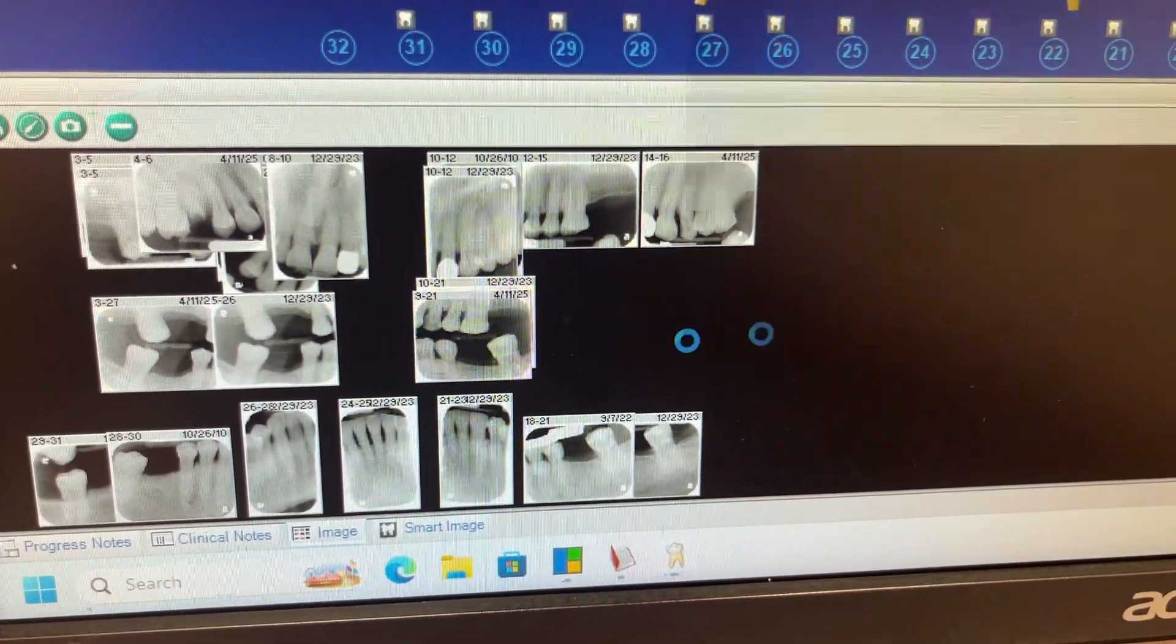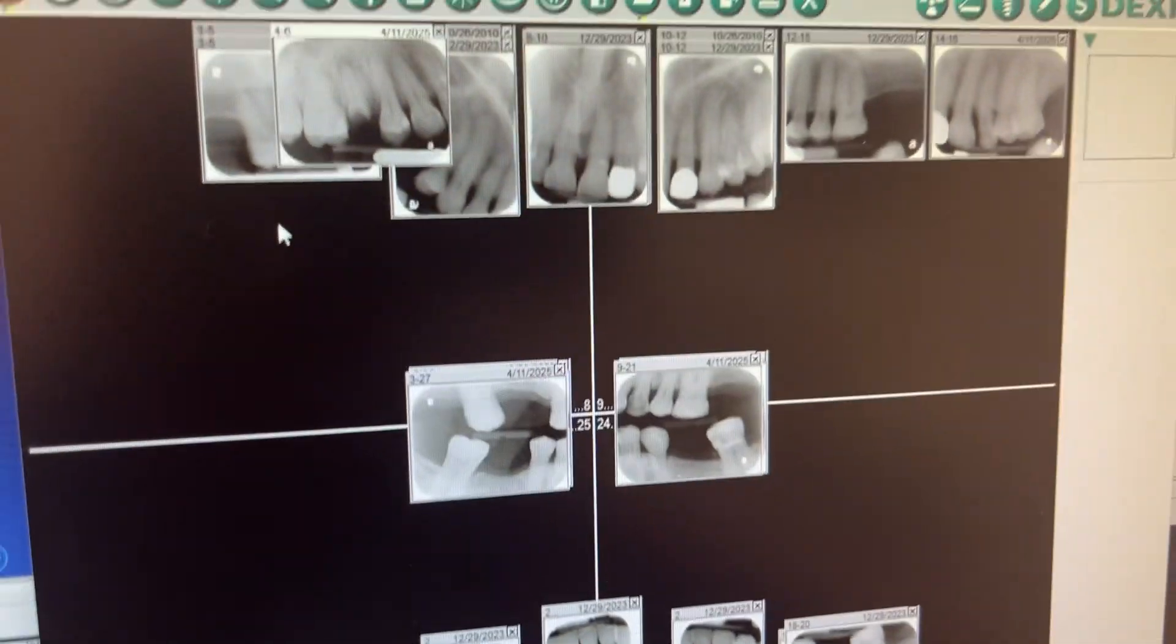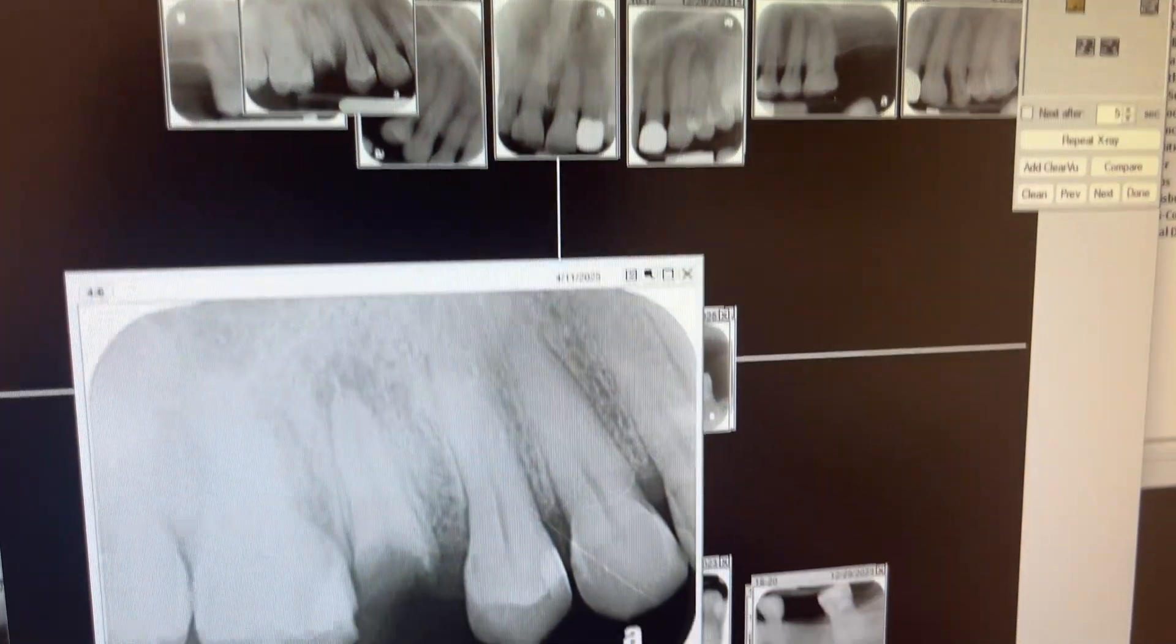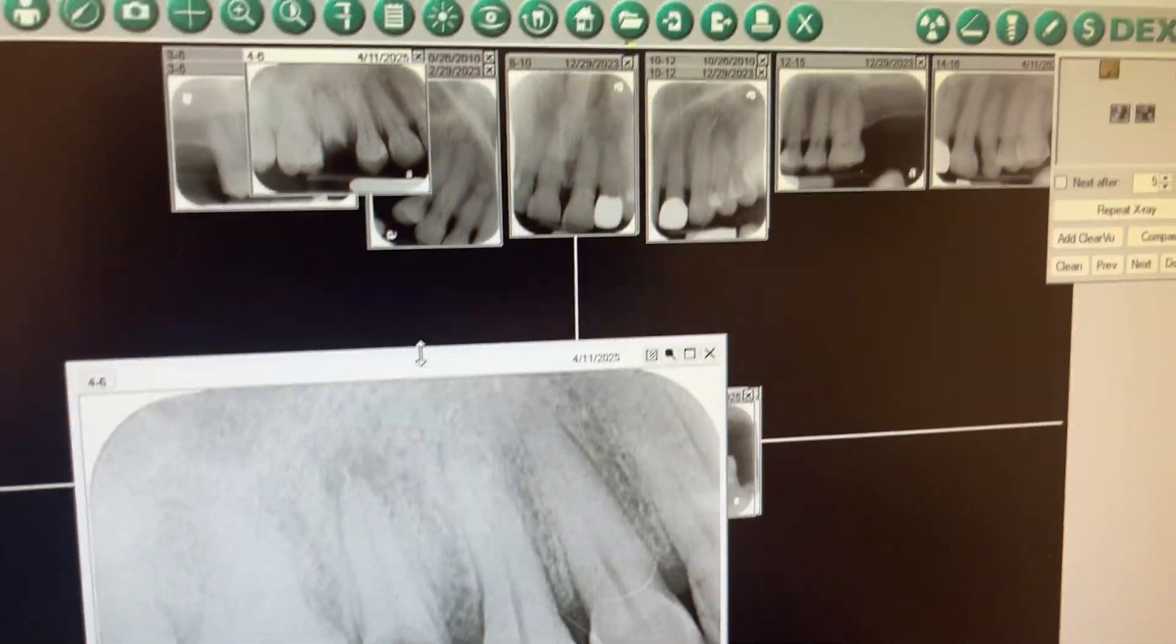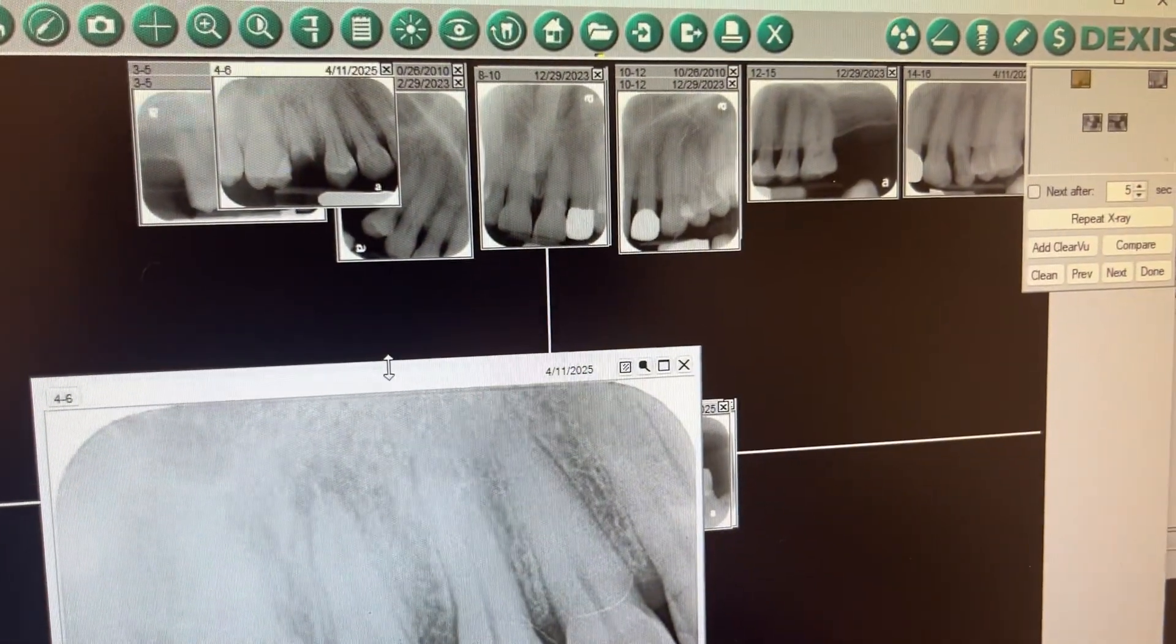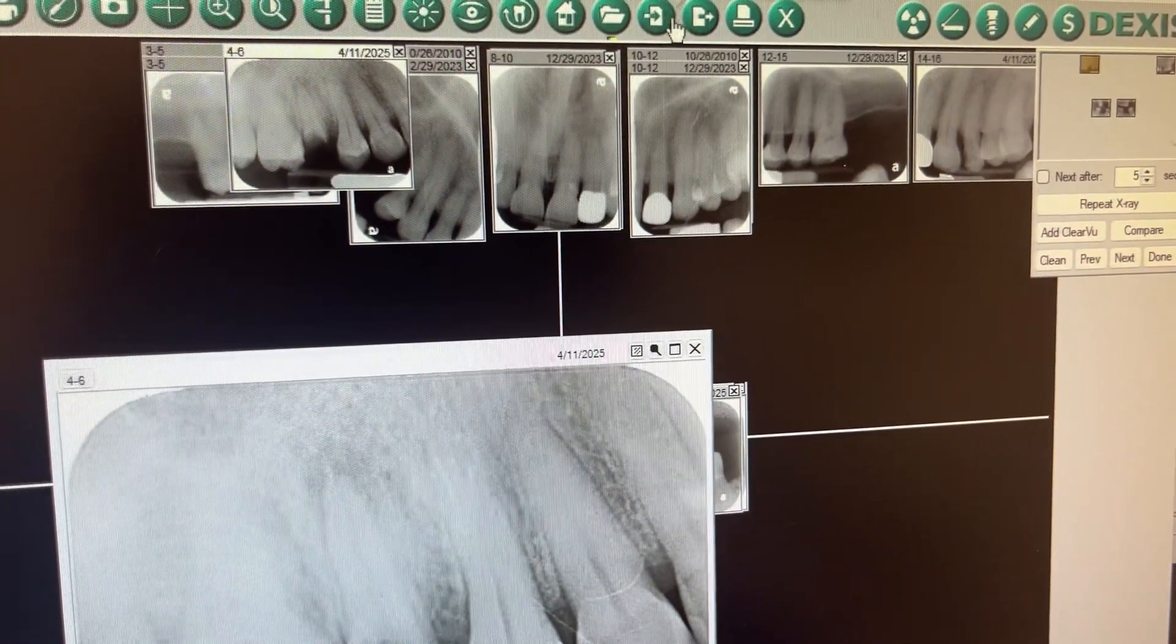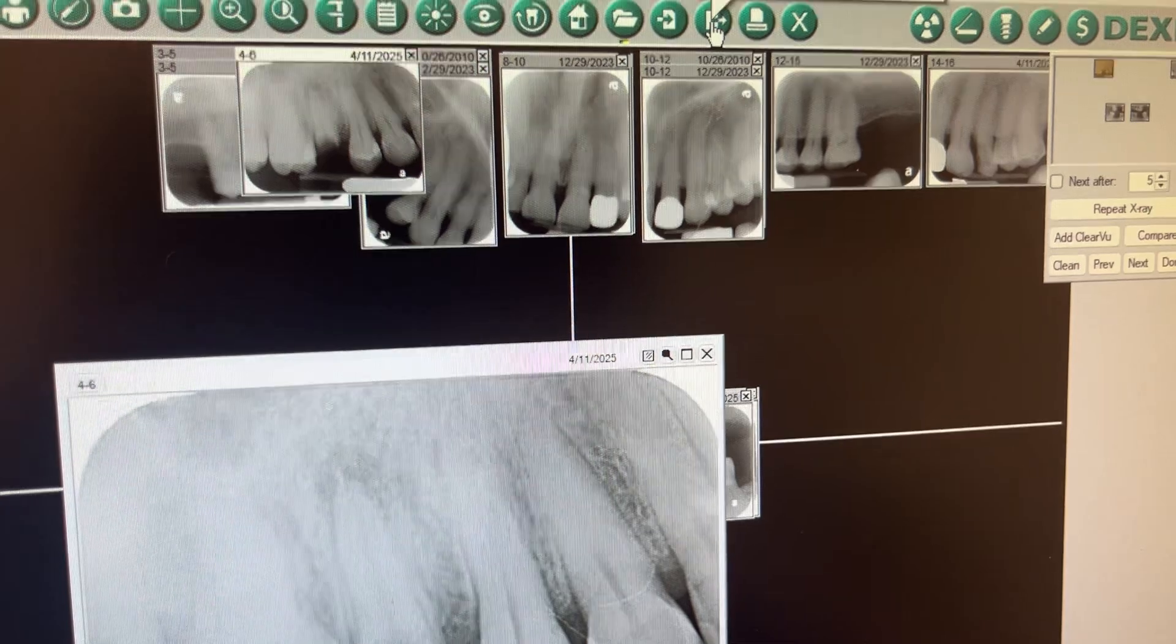So you're going to double click on the x-rays. This screen is going to come up. You're going to click on the x-ray that you want to use. So this is the x-ray that I need to export. So you're going to go up here to the little bars, and you're going to go to where it says export image.